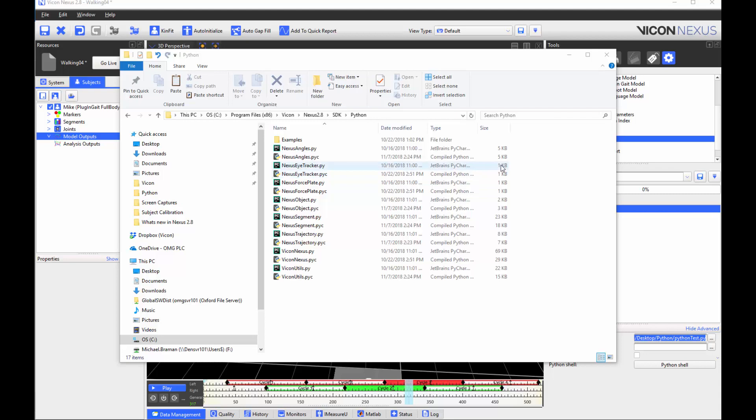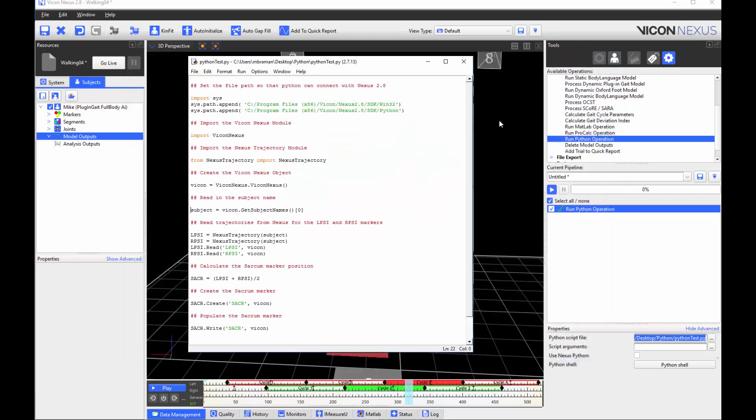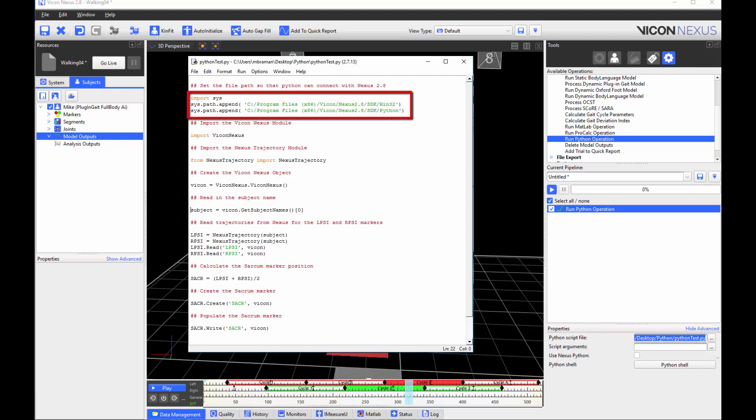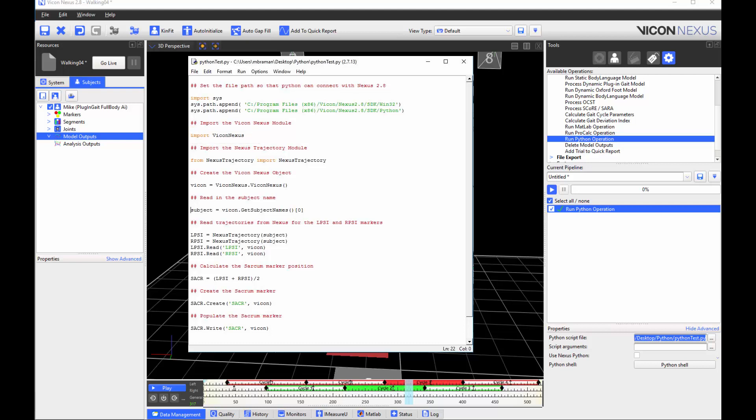I will briefly show you an example script which uses the Nexus Trajectory module. In your script, you will first need to set the appropriate file path, which you can see in the first three lines. The next part imports the Nexus module, and then I import the Nexus Trajectory module.